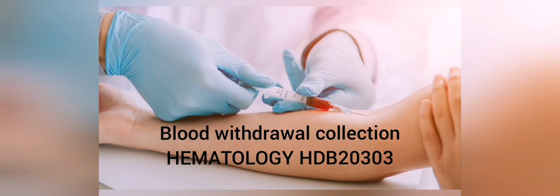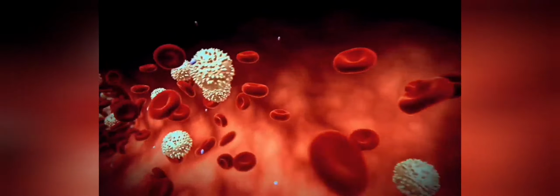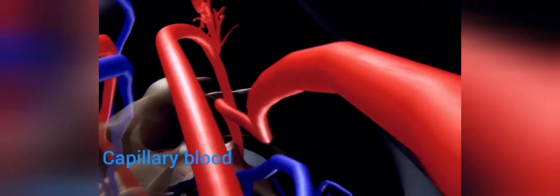In this video, we are going to talk about blood withdrawal collection. Introduction of blood sample collection. As we know, blood specimen is the type of specimen most frequently analyzed in the clinical laboratory. Blood can be collected from 3 different sources. This is venous, arterial, and capillary blood.